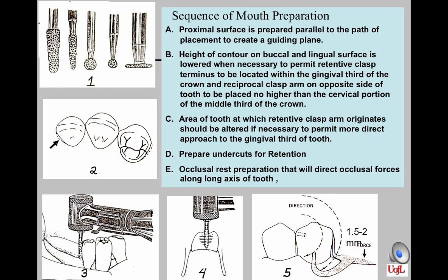On the lingual surfaces, you will sometimes find guiding planes associated with plating or arms for reciprocation. They may help ensure that the reciprocal component protects the tooth from movement when the direct retainer slips over the height of contour. A second reason for a guide plane on the lingual is that it limits the number of pathways that the RPD can be seated, and that increases stability. A third is that it provides maximum resistance to lateral forces.